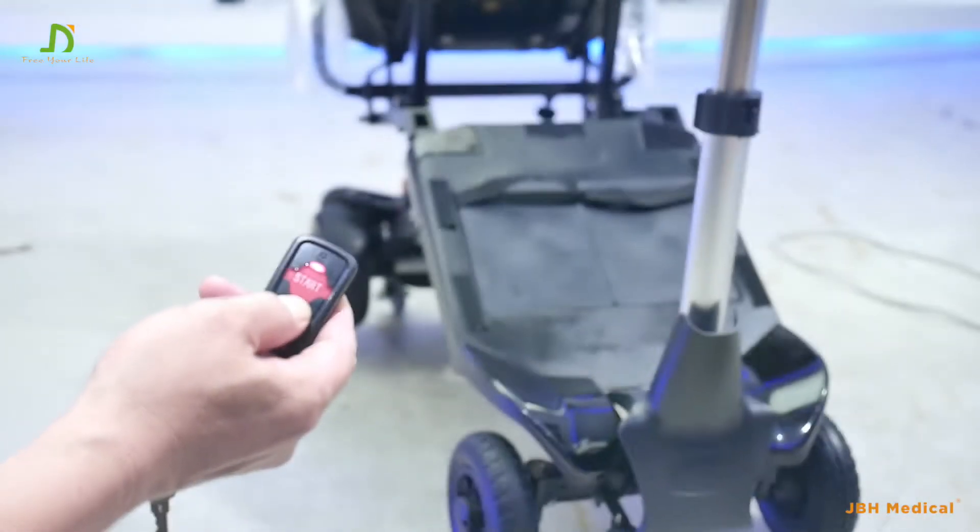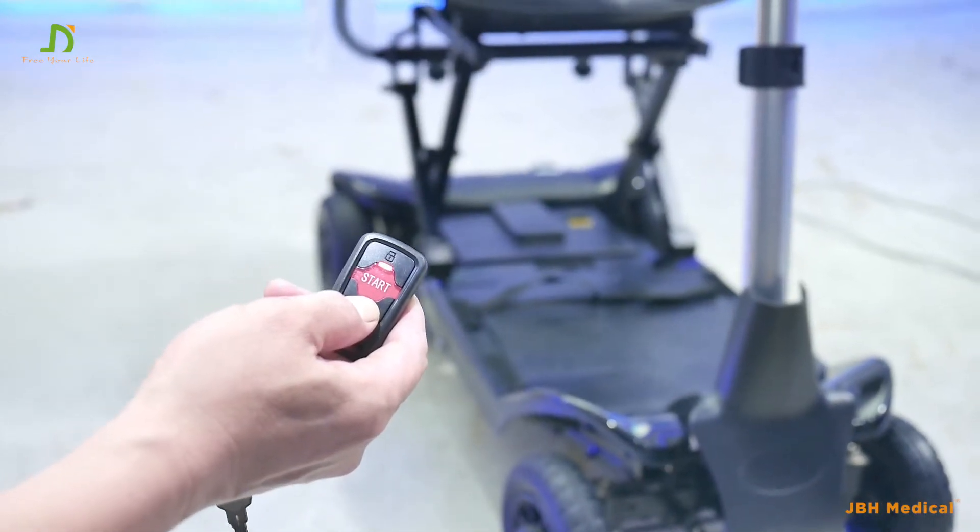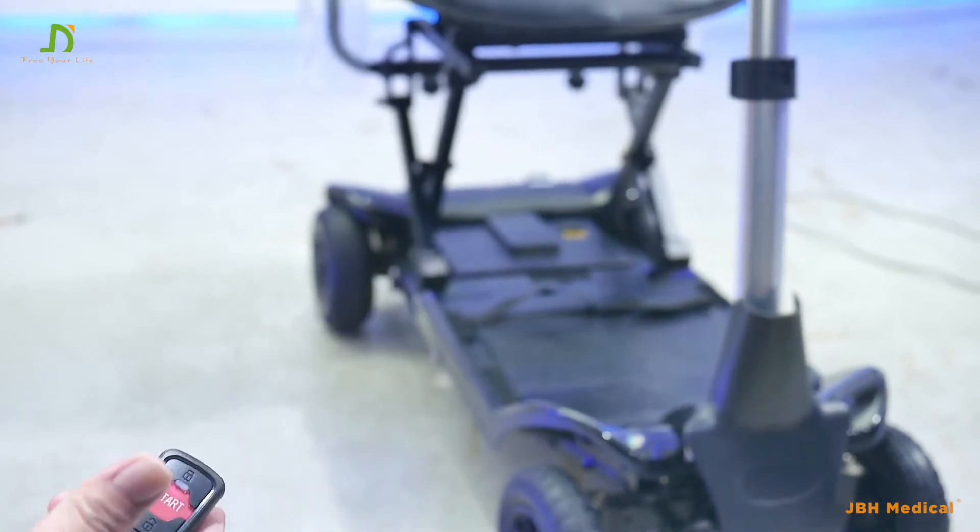Simply keep pressing the button to open the scooter. It will fully automatically open. Once you hear the click sounds, you can release your finger — then it's done.